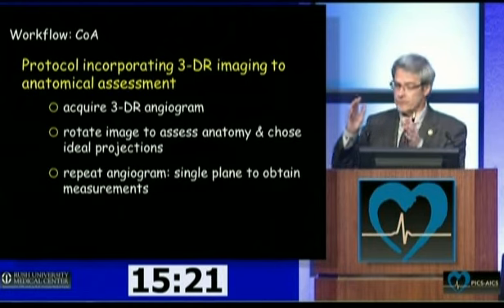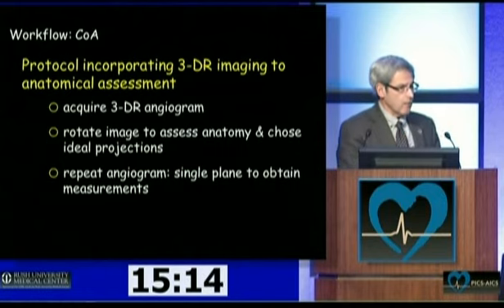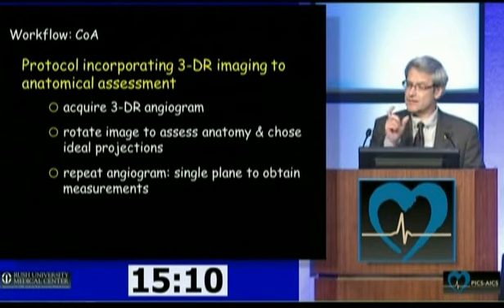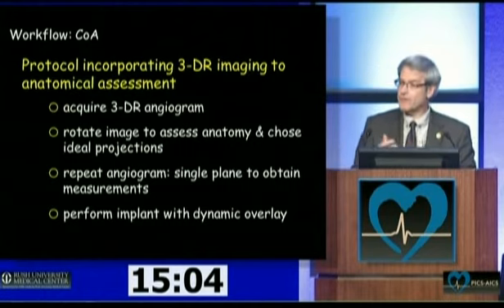It gives you an average, and we're still a little concerned about precise measurements. What you measure on the 3D is what you measure, but it's not systole or diastole. So we repeat the angiogram. I'll show you an example of that. And then we perform the implant with a dynamic overlay.